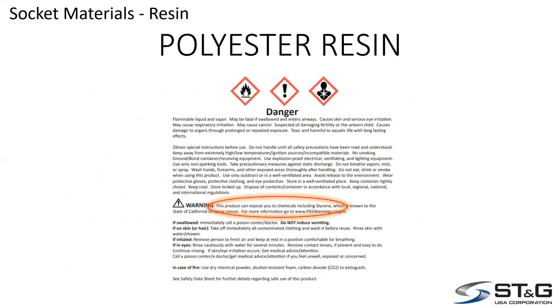Here's a label. It's a warning label, and you can see within the circle, it states styrene. And it's not a very good byproduct to breathe.